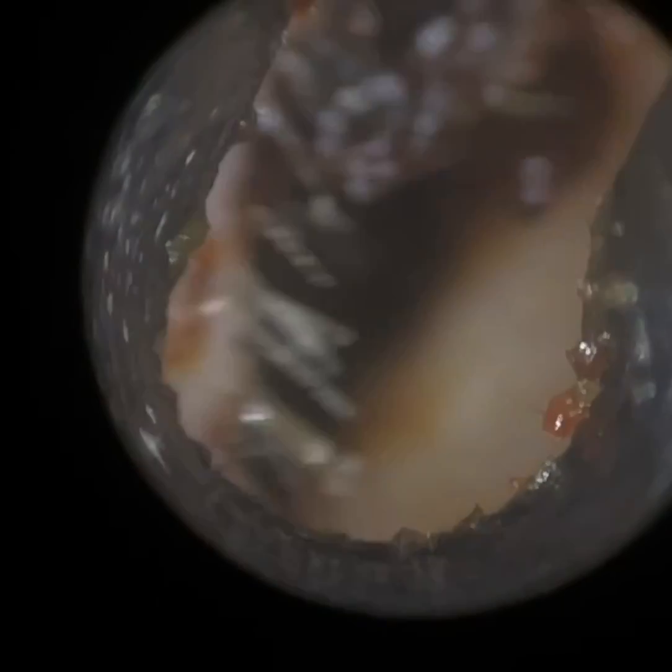It's getting trapped just here at the isthmus region — the region between the first and second bend, which is the narrowest part of the ear. I've managed to roll that ball forwards, just like a bowling ball. But we've got this really more medially-impacted earwax now, which is a lot deeper in the ear, in a similar location to the wax and skin plug I removed from their left ear.